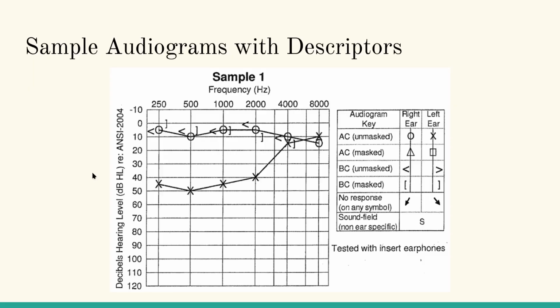I think that's overly verbose in my opinion. This is an opinion. Left ear showed a moderate conductive hearing loss through 2000 hertz. I think that's a better description, personally. I think being brief is better than being overly verbose.